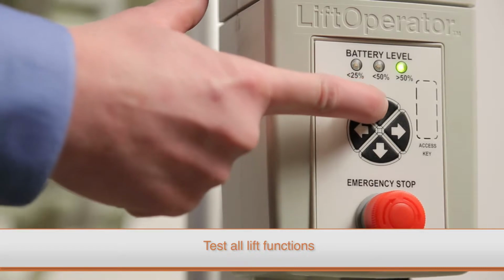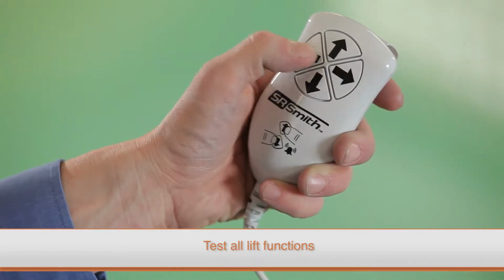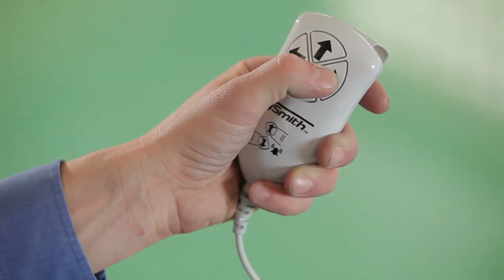Test all lift functions with both the touchpad control and the hand control to ensure that the lift operates properly.